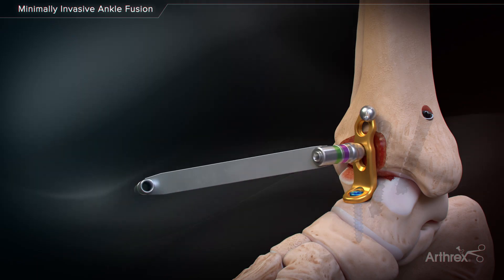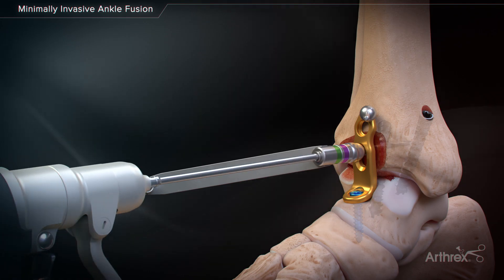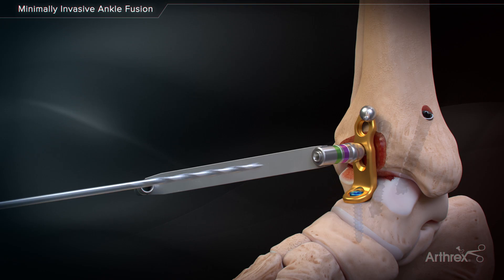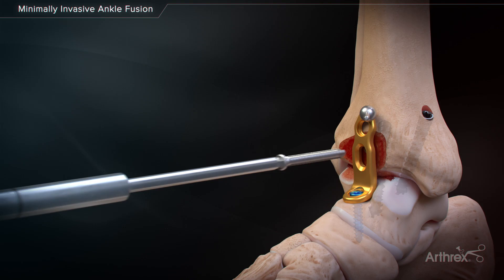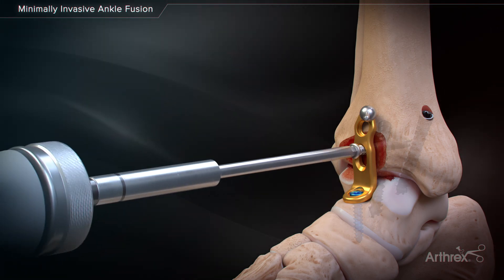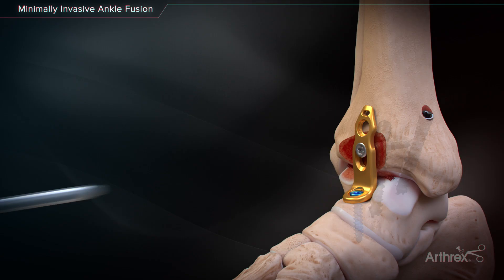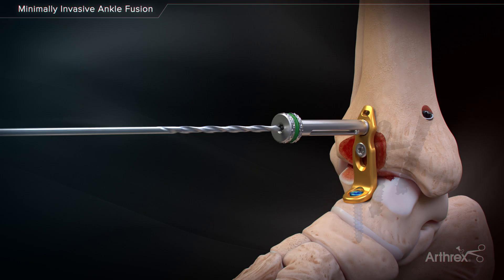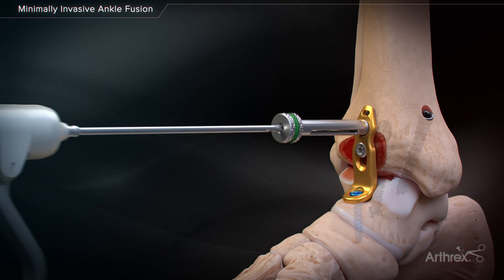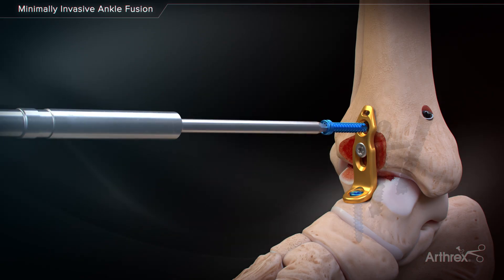Additional compression is then obtained by inserting a 4.5-millimeter non-locking screw eccentrically in the oblong hole. Prior to inserting the screw, remove the proximal temporary fixation. Complete the construct by inserting either a locking or non-locking 4.5-millimeter screw in the remaining tibial hole.